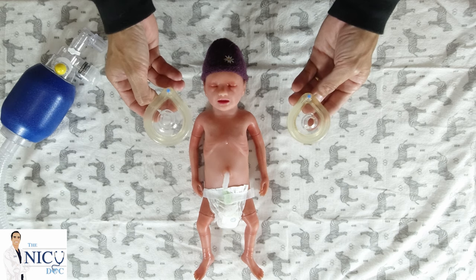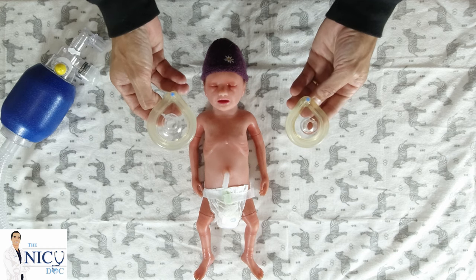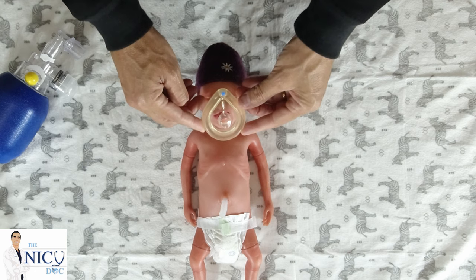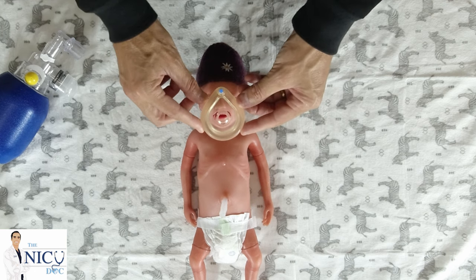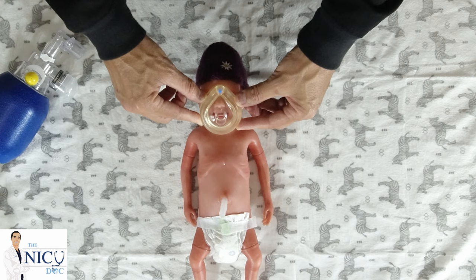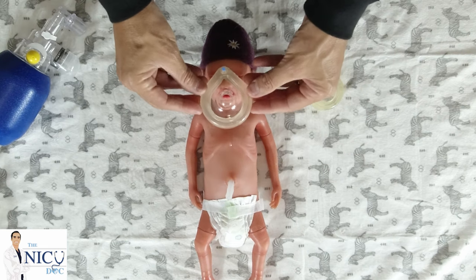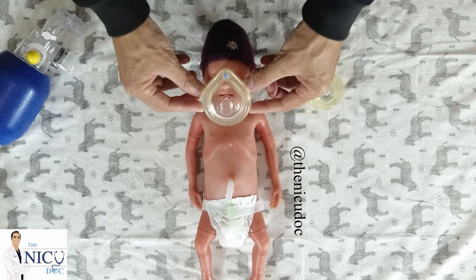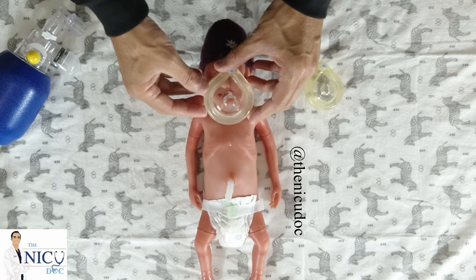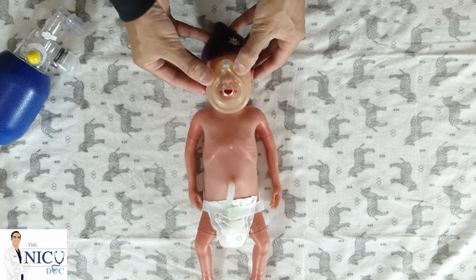Here's an example of the two masks we can use. This is the smaller mask. The medium size — there is a larger mask for babies that are LGA or four kilos or above. For this preemie, we want to select the smaller mask. When selecting the mask, you grab from the tip of the nose down to the chin and make sure you don't have an area that's overriding. If you choose the wrong mask, it passes over the area of the chin and air would come out from the sides.